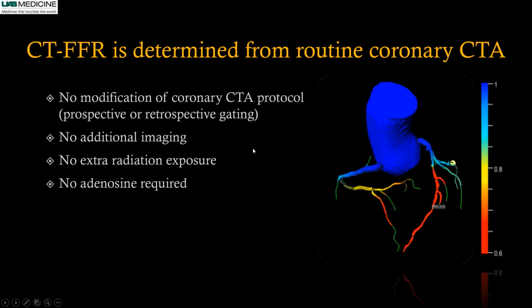So when we look at catheterization, if you want to check the hemodynamic significance, we have to do invasive FFR, fractional flow reserve, which requires a wire passing through the area of stenosis and looking at the pressure beyond and proximally and correlating with the aortic pressure. If it is less than 0.8, it suggests there is significant stenosis which needs some kind of intervention.